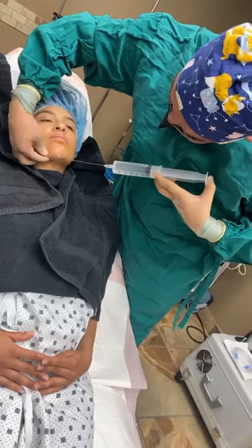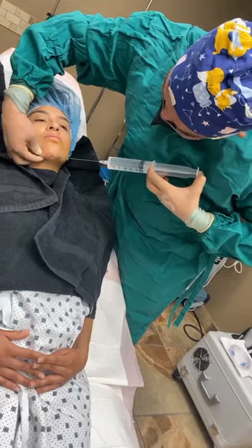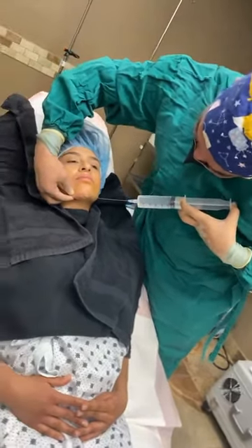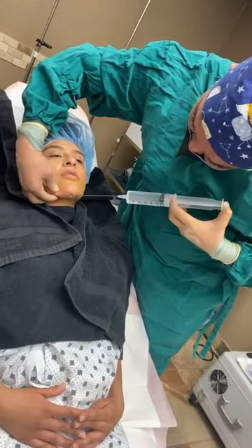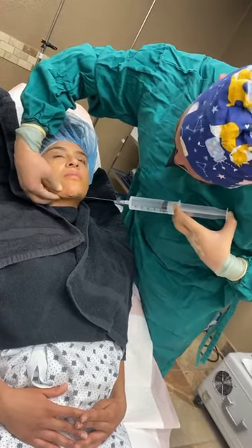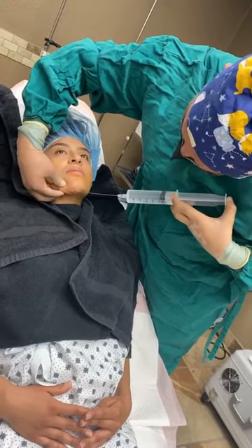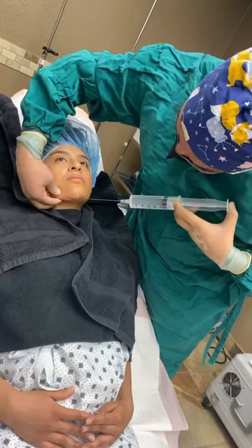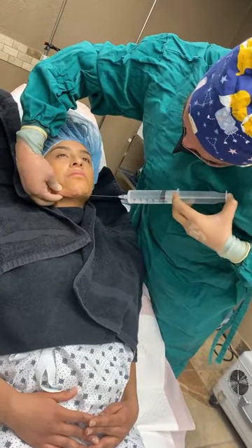And so you can see how thin this area is. So you have to be careful exactly where you're putting that cannula or the needle. Are you numbing? Mm-hmm. If you don't feel the actual needle, then it's numbing already.